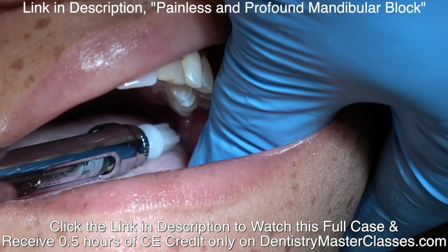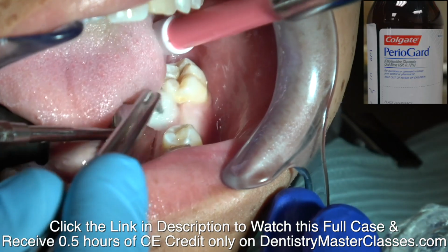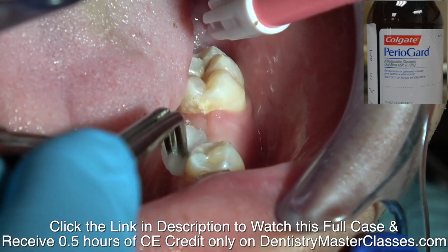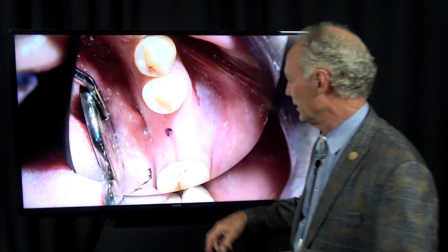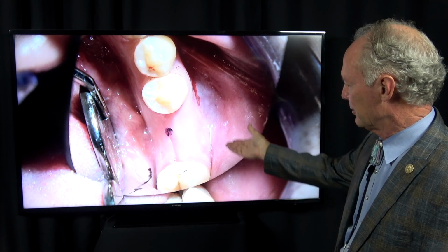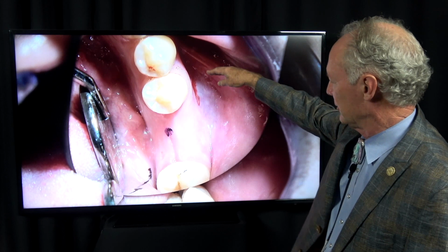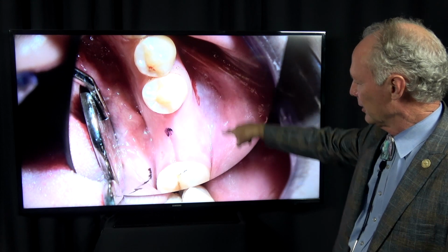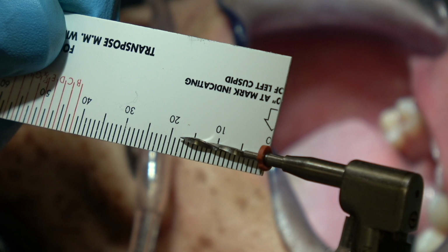I'm going to use a pilot drill with an endostop, local anesthesia. Then I'm wiping the surgical area with chlorhexidine. Then I'm going to dry it, and then I'm going to put a dot with a Sharpie marker right in the center. Now many times I'll use a surgical guide, but often if it's a single tooth, I won't, especially if it's in the posterior area. I'll just put a dot, and if the angulation of the adjacent teeth is correct, the roots, then I'll stay in line with the adjacent teeth and place my implant in that dot in the center of the area.